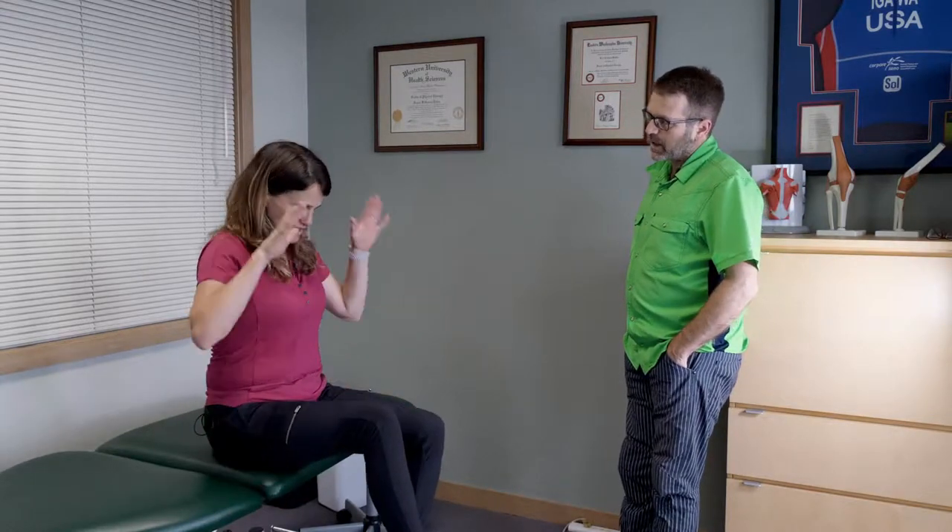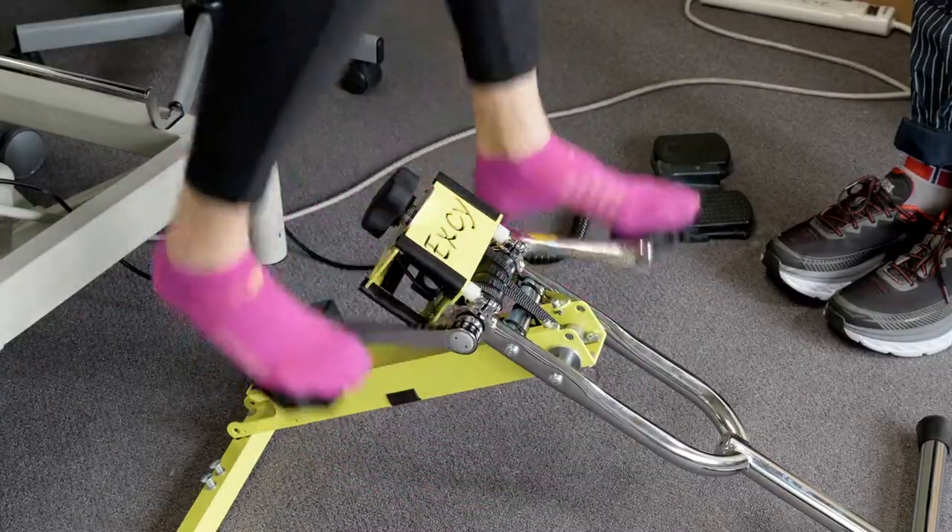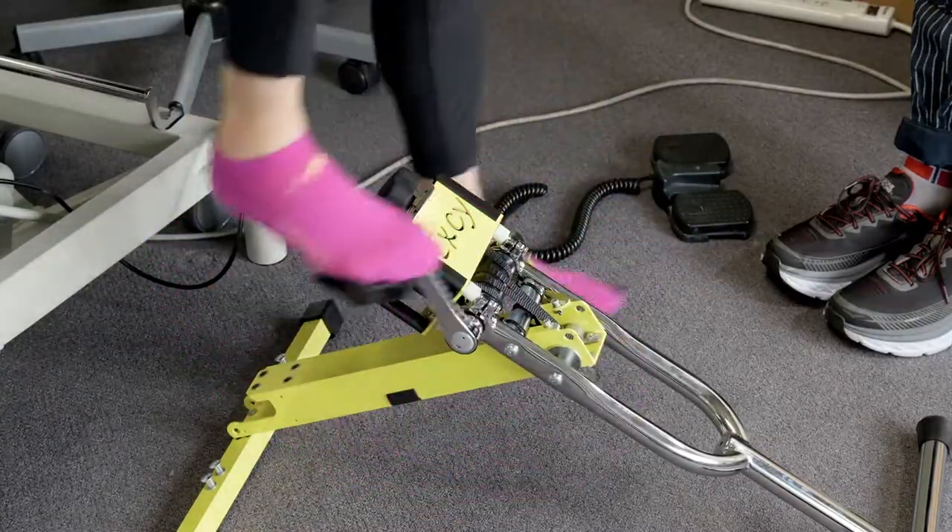So many PT clinics have these low tables, and hospitals too. What we find is that in a hospital situation, just getting people moving, and in a PT situation, getting them warmed up for whatever you're going to be doing. So maybe we can talk about how to leverage these tables using the XC as a cycle on the side.